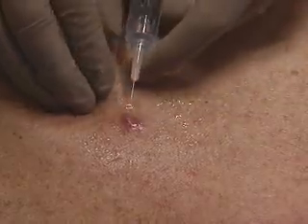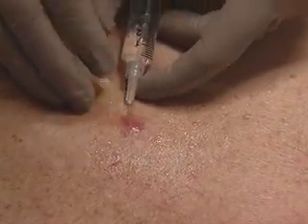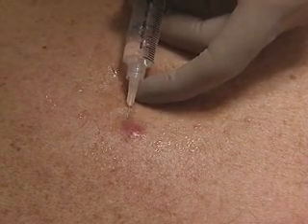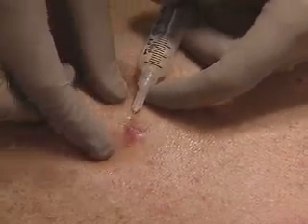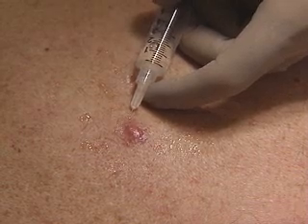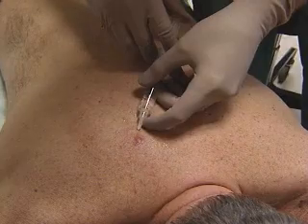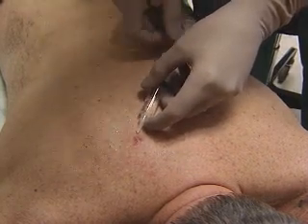Observing universal precautions, we've prepared the anesthetic. Make sure the bevel faces up and the anesthetic is injected slowly as you withdraw the needle. We infiltrate the anesthetic around the cyst, into the surrounding tissues, not into the cyst itself.